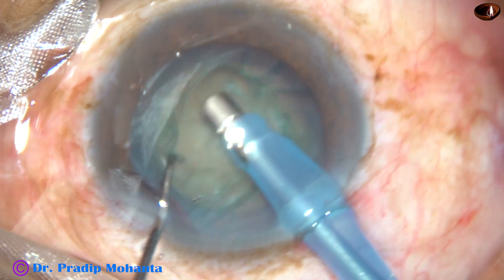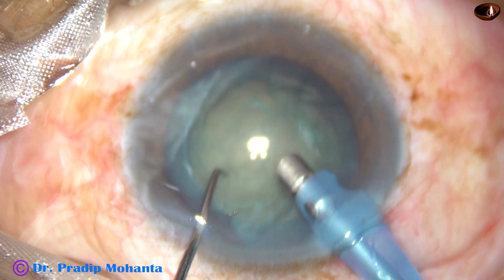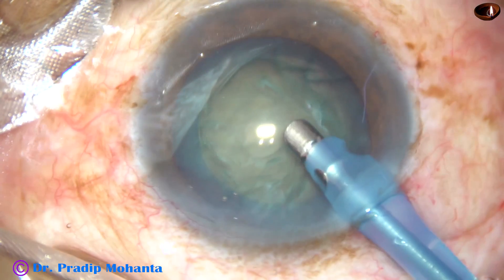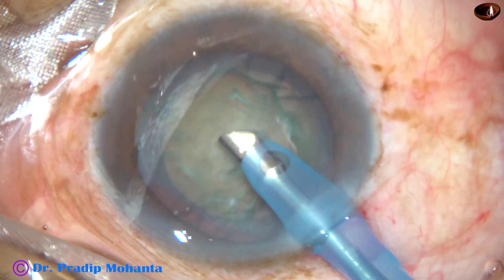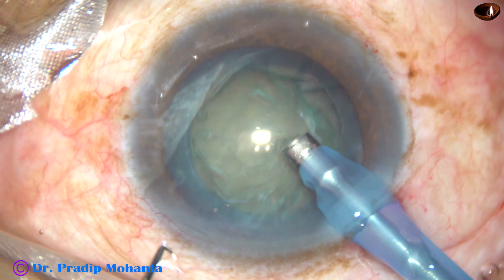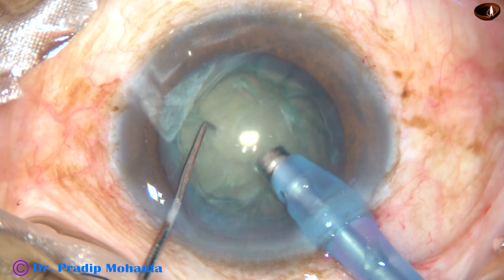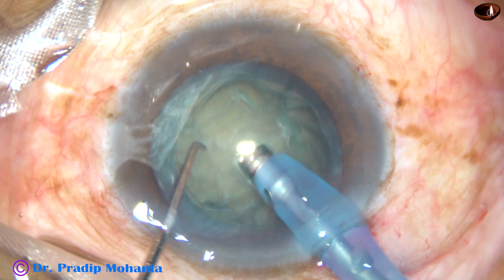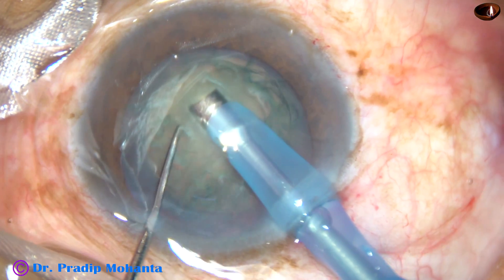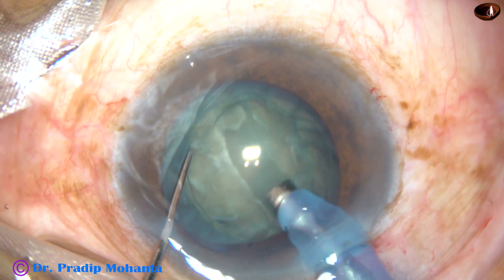Remove some superficial cortical matter. And then, turn the tip with the help of your left hand so that the bevel is up. Introduce the chopper again. And now, make a trench. The trench should be through the center of the nucleus and it should be a straight line.